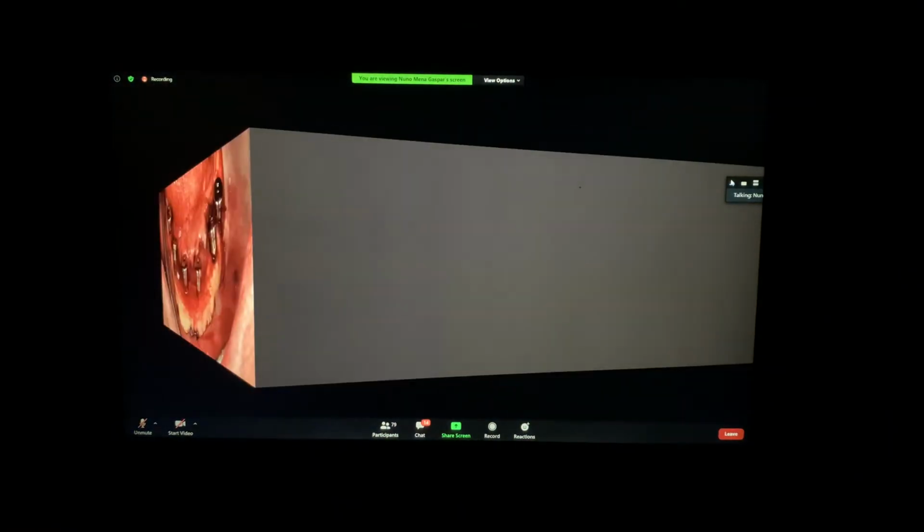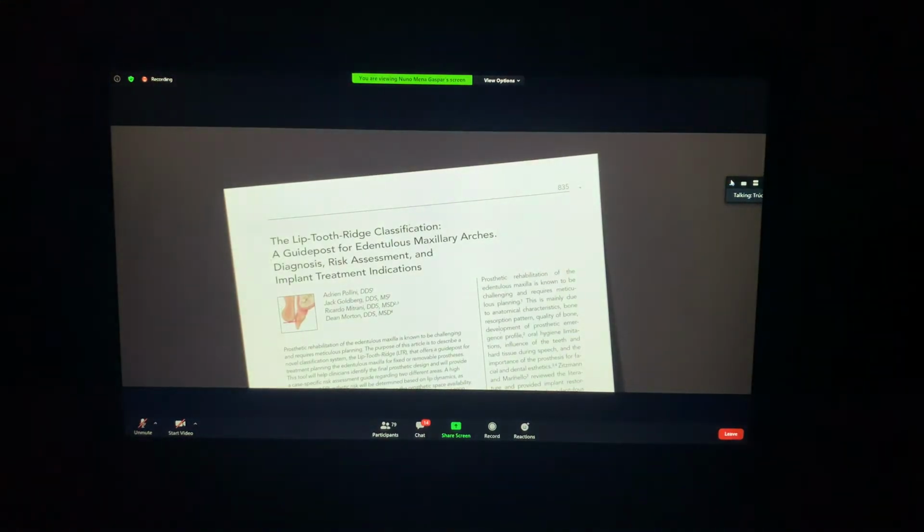But Janssen has the way of viewing this bone reduction like a surgeon. So we don't do only the surgery. You need to do the prosthetics. You need to know at least how the prosthetic is done. So maybe to know how to do the bone reduction, we should have a prosthetic way to view it. Và để được mài xương ở một cái đạt cái kỹ thuật cao nhất đó, thì chúng ta cần có những cái kỹ thuật.